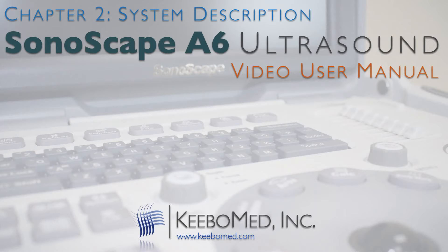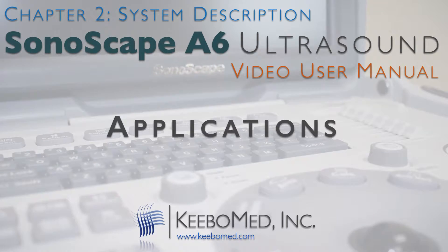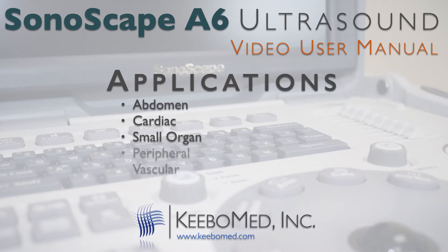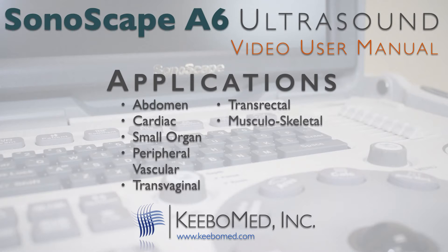The A6 is a general-purpose ultrasonic imaging instrument intended for use by a qualified physician for evaluation of abdomen, cardiac, small organ, peripheral vascular, transvaginal, transrectal, musculoskeletal, pediatric, fetal, OB and GYN, and urology.